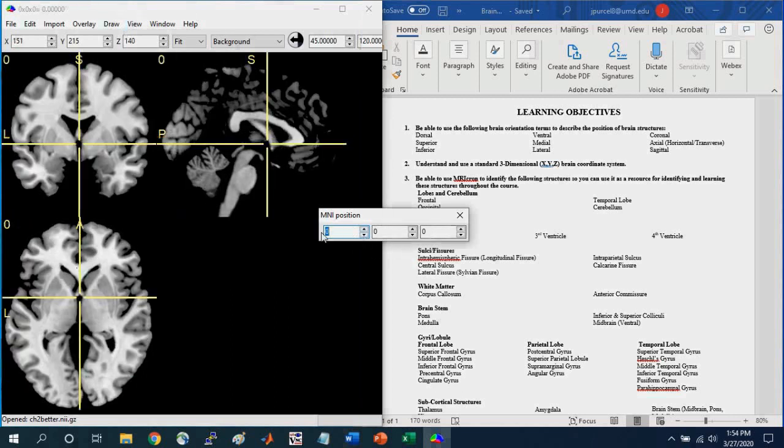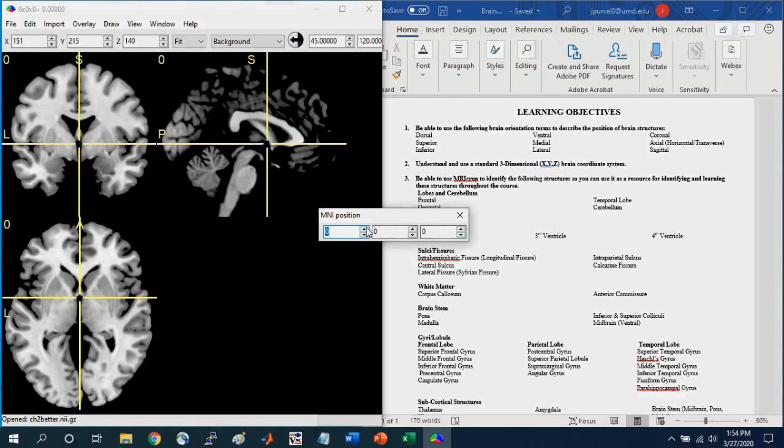So here's the very kind of center of this standard coordinate system.